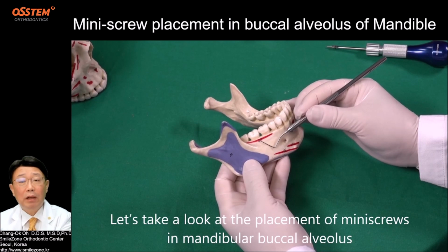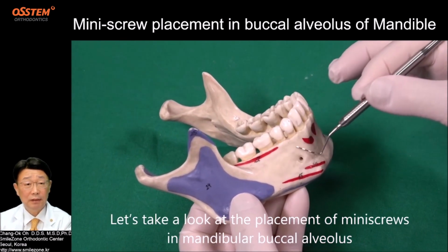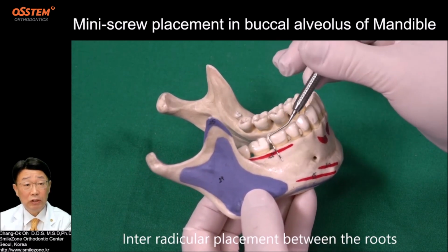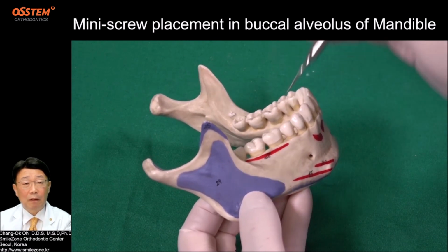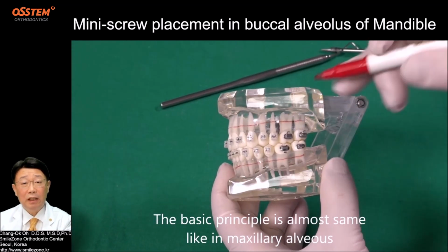Take a look at the placement of miniscrew in mandibular buccal alveolus. Interradicular placement between the roots. The basic principle is almost the same as in maxillary alveolus.